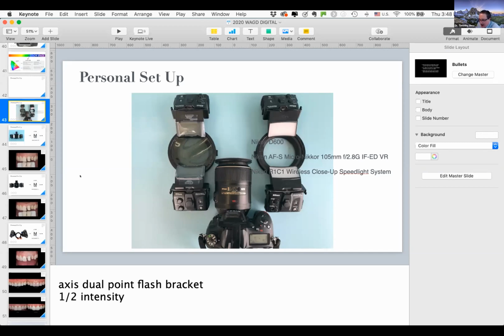So here's a question about black contrasters. Do they help with shade selection? Do you personally use them, or do you post-edit to create a black background? I like to use black backgrounds, but that's more for artistic shots or post treatments. I don't usually use them for shade taking.